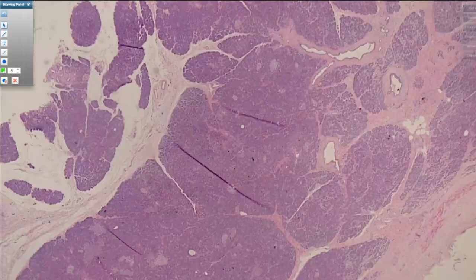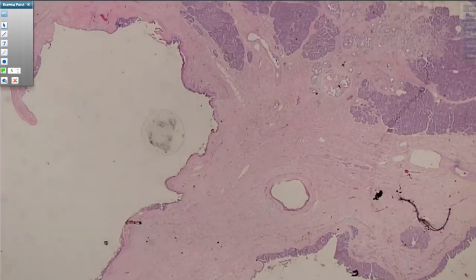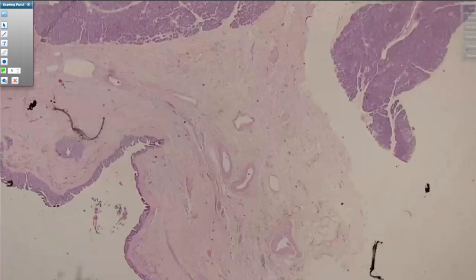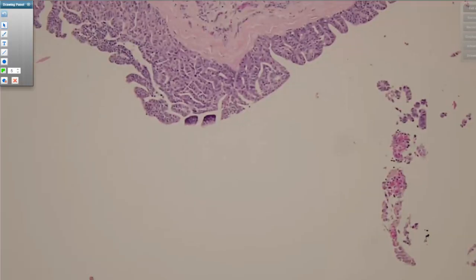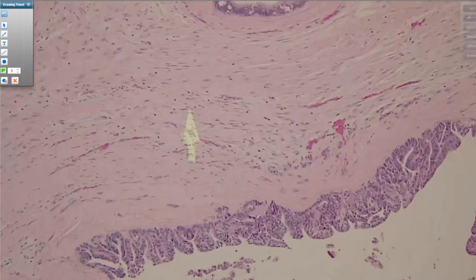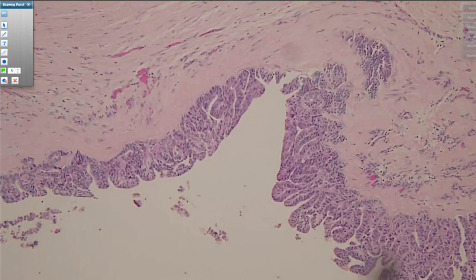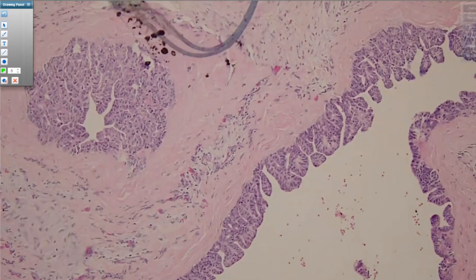The last intraductal thing I'm going to talk about is called an intraductal tubulopapillary neoplasm, which again has distinct genetics from an IPMN, and again is very rare. They're comprised of these small, often dark cuboidal cells with a combination of tubular and papillary architecture. And sometimes the papillary architecture is really less prominent than the actual tubular formation.